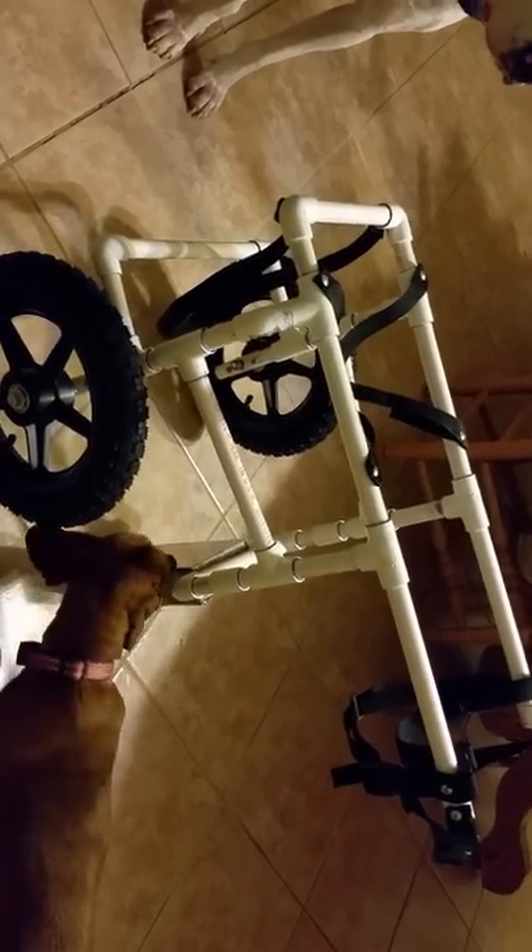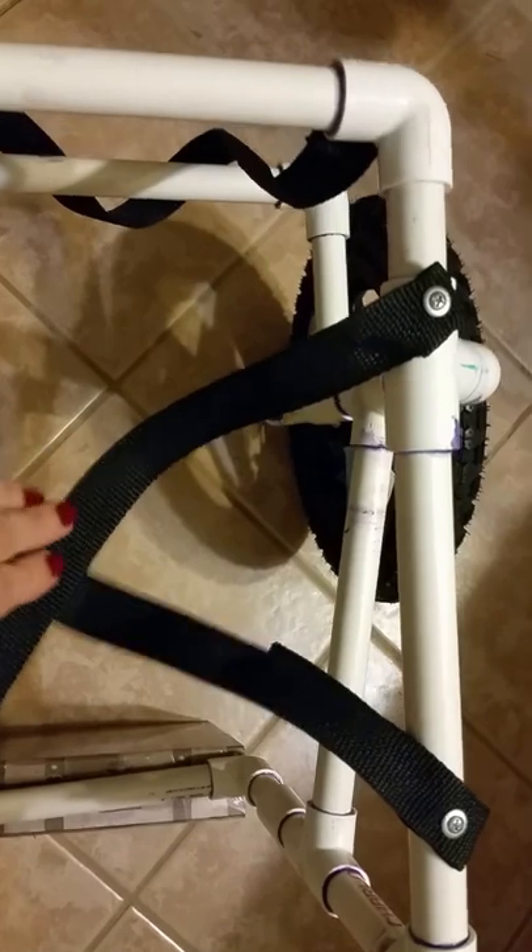This is what our finished cart looks like — it's for a 55 pound border collie mix and we have it propped up on a box. Ideally when you put this cart on a dog, you don't want it to be uphill — you want it to be level or slightly downhill. Notice that the center of the saddle is in front of the axle of the wheel.